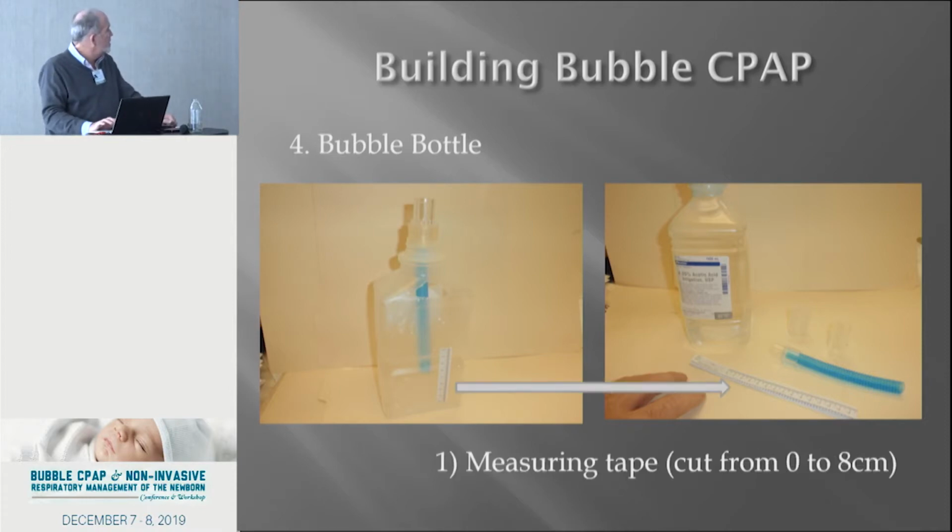And there's 5 pieces. There's a piece of tape, which we would take the tape, cut it at 8 centimeters, turn it over, tape the 0 where we wanted the water level, going down to 8. Dr. Alley originally wanted 7, but I brought him the cheapest bottle of the month, and whatever was cheaper, they're all manufactured slightly differently, and the underside of the bottle extends up into it. So sometimes, if it was too long, it would be hitting the plastic at the bottom, so we had to make a few changes there with that number.